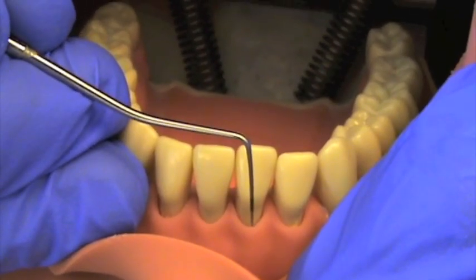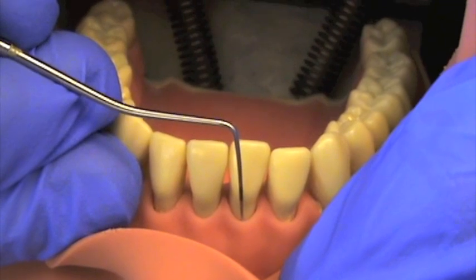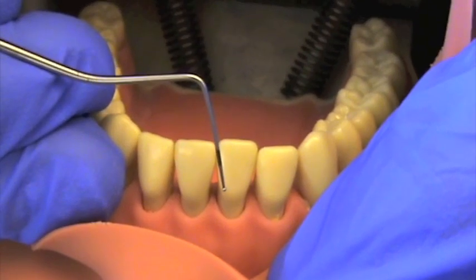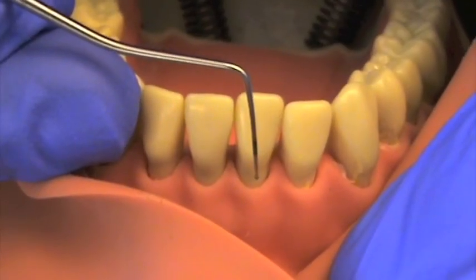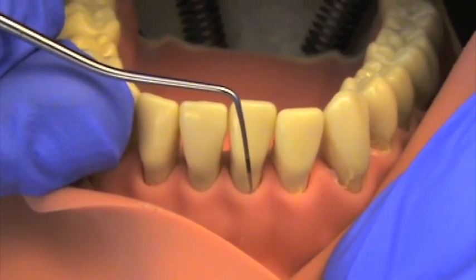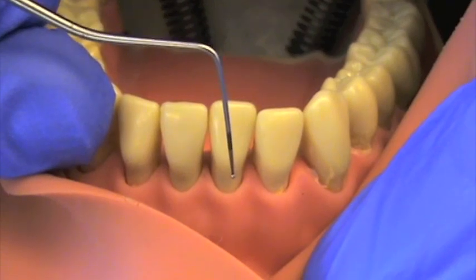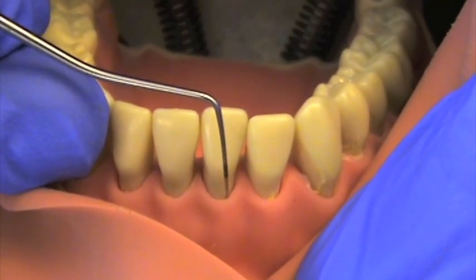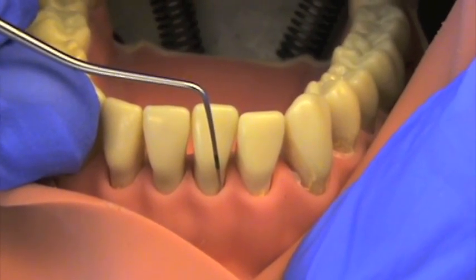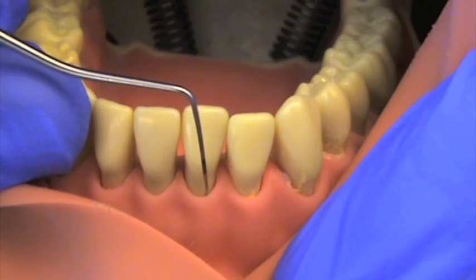If we probe into the gingival sulcus and the whole of the black band is showing, there is no calculus, no overhangs, and there is no bleeding after probing, this would be a code 0. Code 1 is when the whole of the black band is showing, there is no calculus or overhangs, but there is bleeding after probing. Code 2 is when the black band is showing but you have either supra or subgingival calculus and/or overhangs.